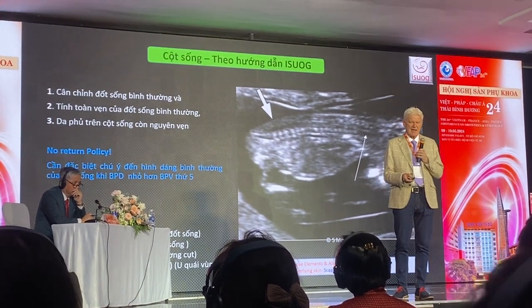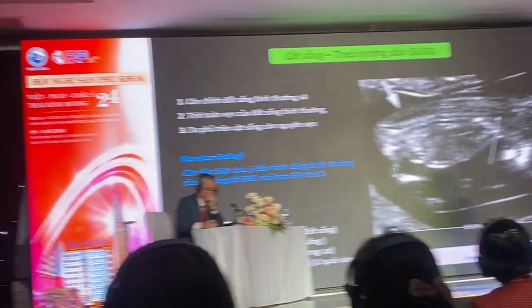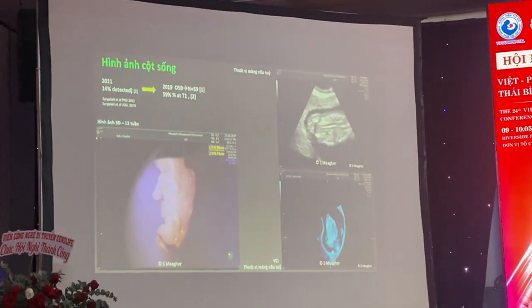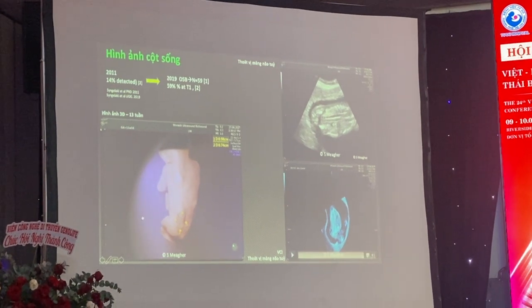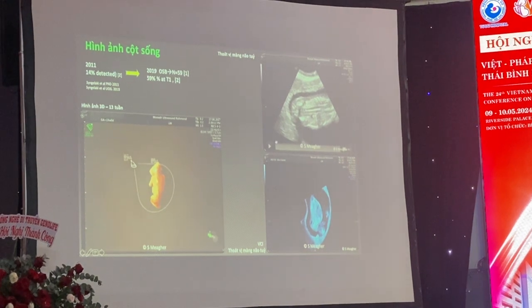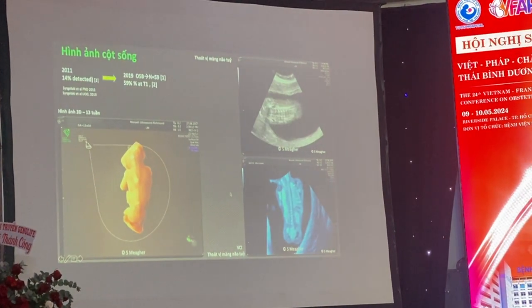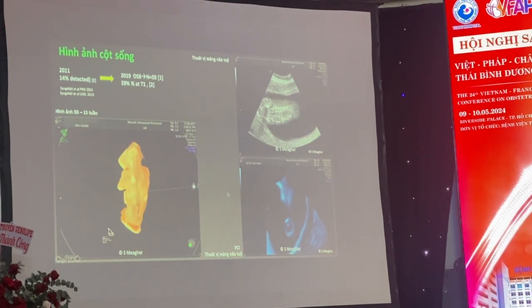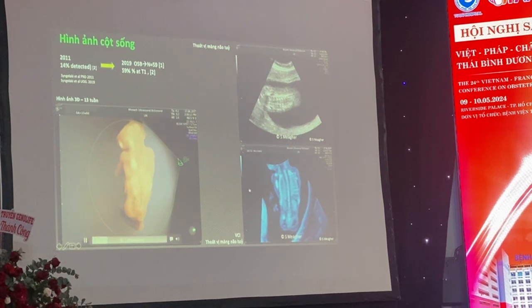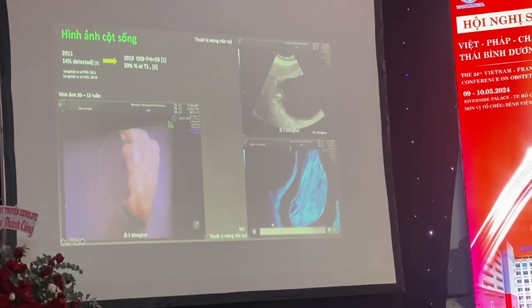What about the spine? Well, with the spine, the main reason for examining the spine is spina bifida. So we go to the next slide. If you look at spina bifida, this is a fetus at 13 weeks with spina bifida, you will find that approximately 30% of spina bifida, you will see the defect in the first trimester by looking at the spine. If you can't see something on the spine, then you are relying on the head measurements. And there are 15 indirect head measurements.